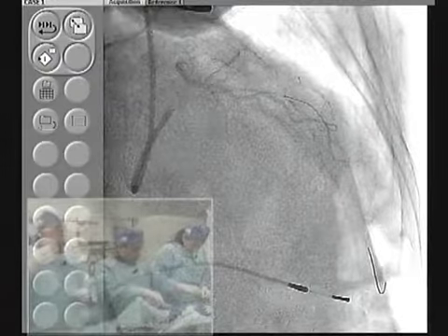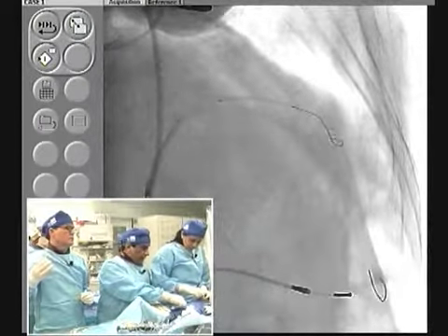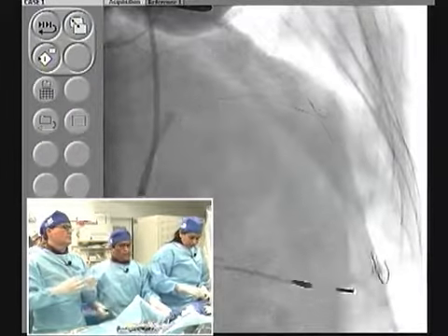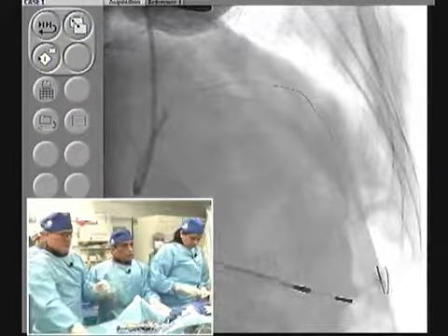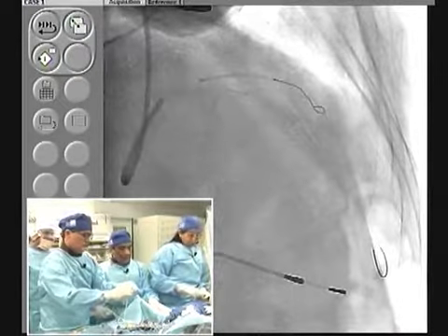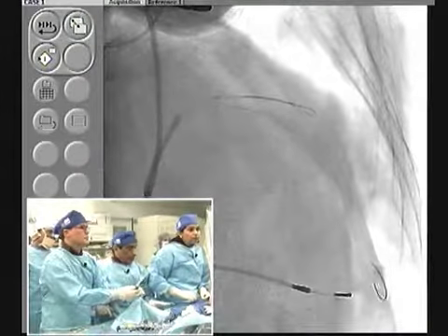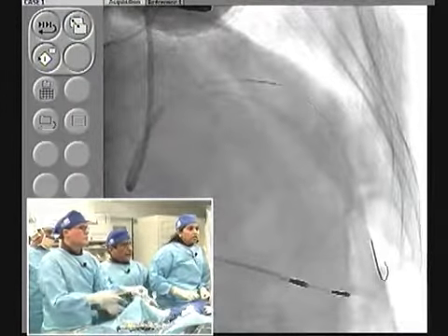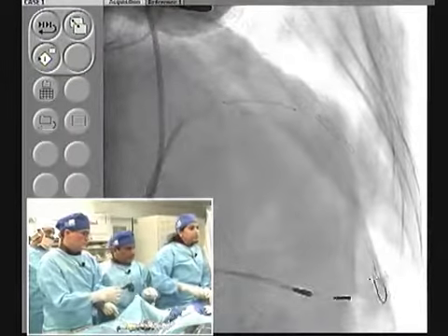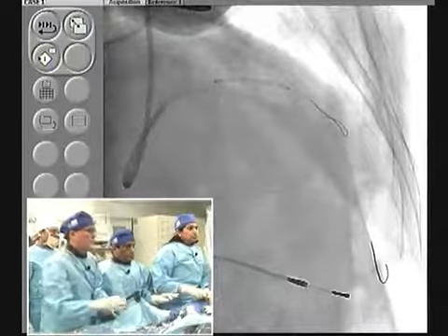Let's go again. Because we have done so many movements, from a technical point of view, if our decision was to put a stent in the mid to distal LAD, it should have been done first, before putting a stent into the diagonal. What will happen with this multiple wire movement is the intertwining of the wires, making it difficult to advance your stent.